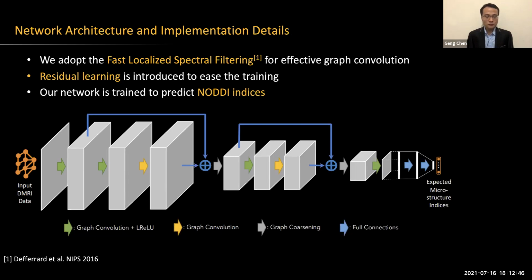Yeah, I think it is a good idea to explore the potential to combine convolutional neural networks with graph convolutional neural networks, because for diffusion MRI, although it is high dimensional data, after using certain data representation methods it can still be viewed as images. Even though there is some loss of information, it is still okay to use CNN to extract informative features from the diffusion MRI data, and then we are able to combine it with the information provided by graph neural networks.